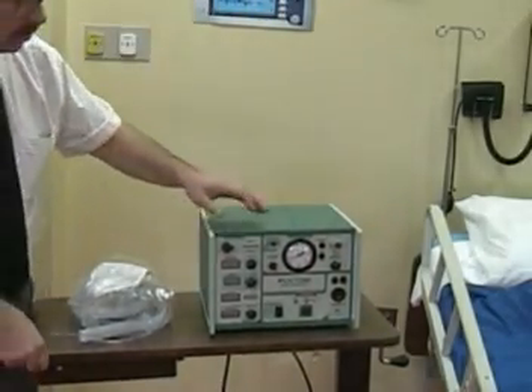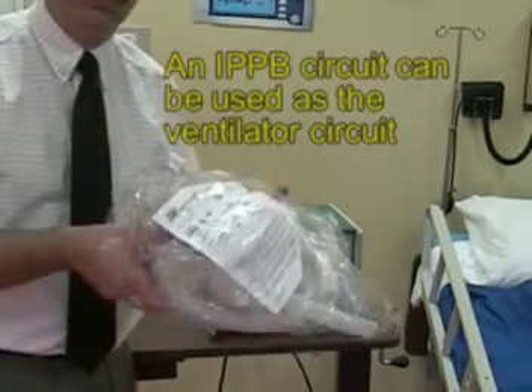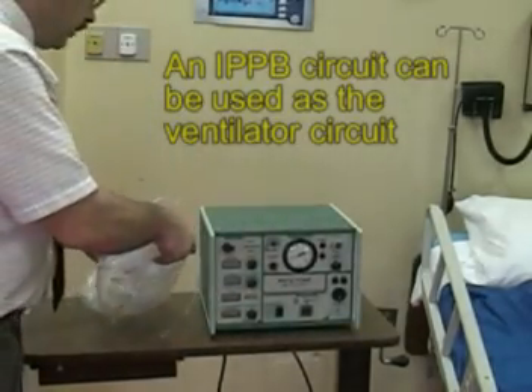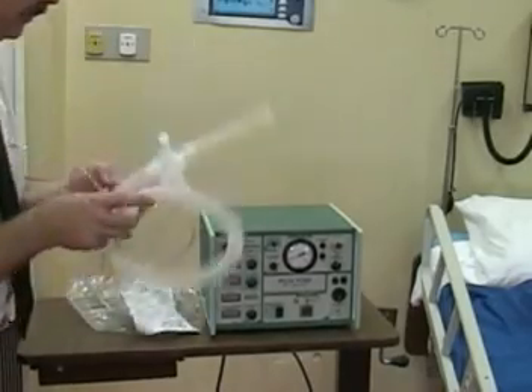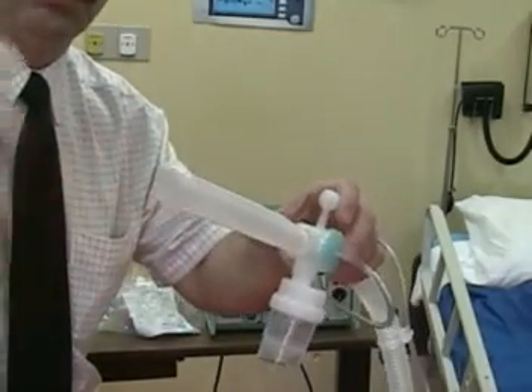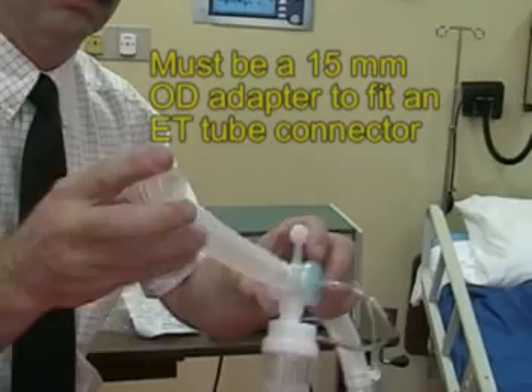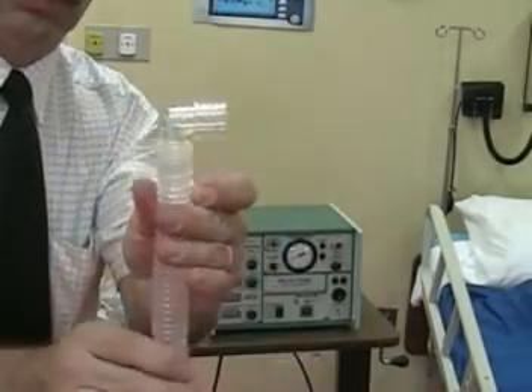Next, you will take a typical IPPB circuit, set it up as you would for an IPPB treatment, and then at the end of the flex tube you need to put a ventilator connector so that you can attach that to an endo tube.